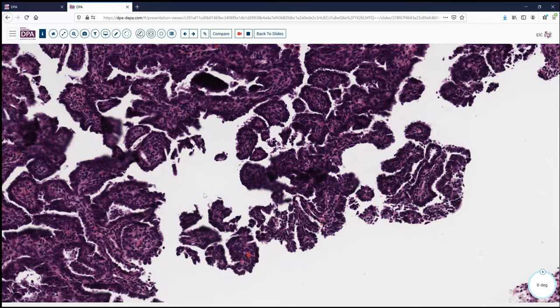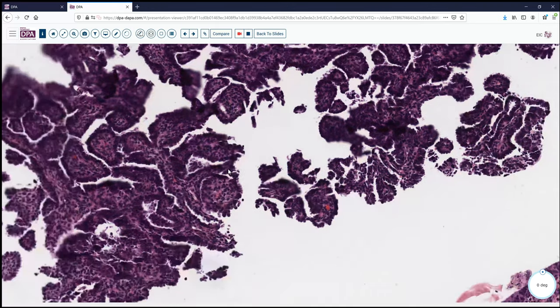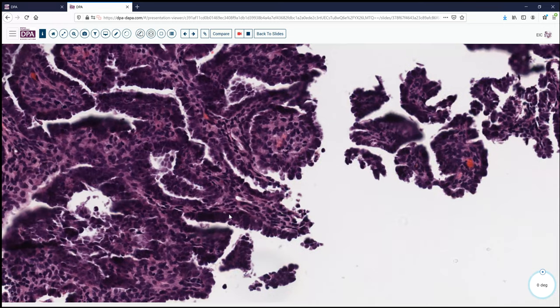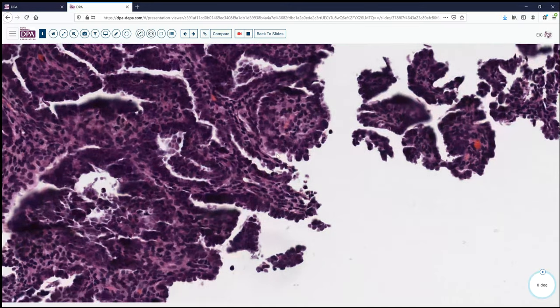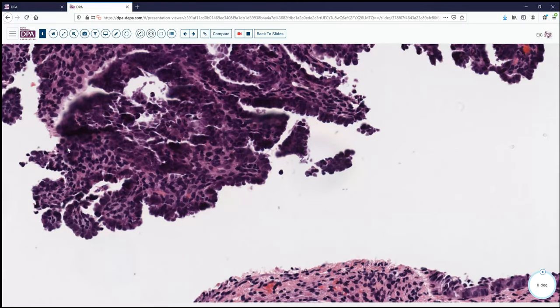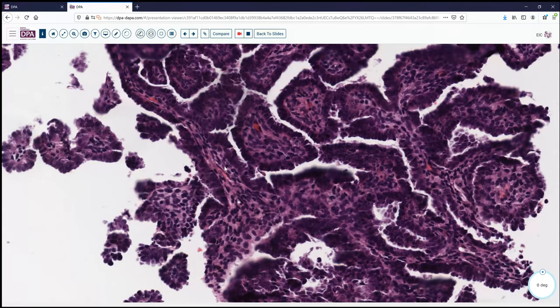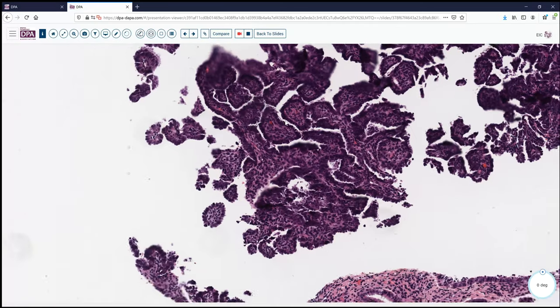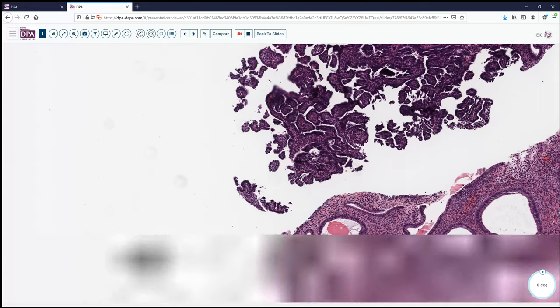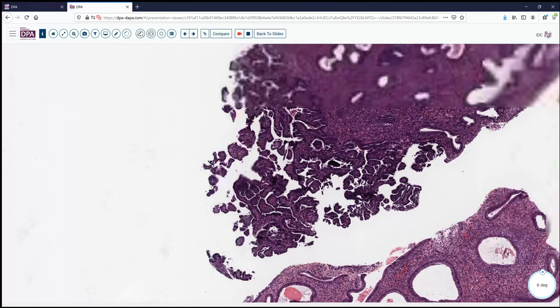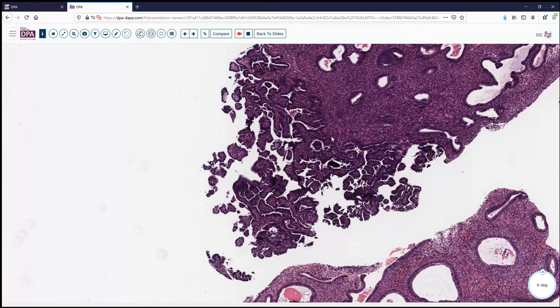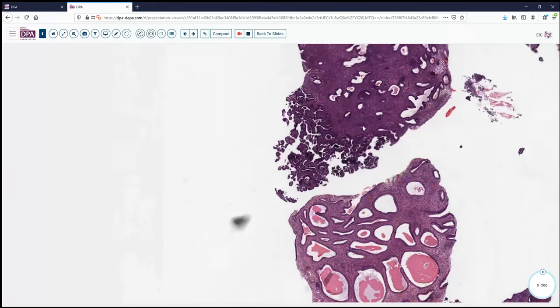As we look at these cells, they look a little different than those elsewhere — smaller, with more nucleus to cytoplasm. We see little tufts, almost little hobnail-type projections in some of them. And we can see in a few areas nuclear debris, evidence of higher-grade nuclear activity and cellular turnover. So with this very papillary architecture and the accompanying nuclear atypia, we wonder: is this serous carcinoma, serous-type adenocarcinoma, or is this an in situ lesion?